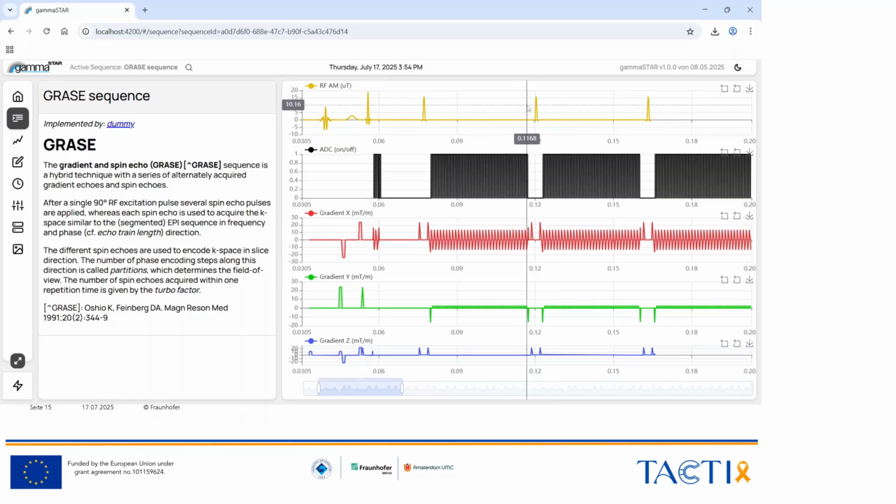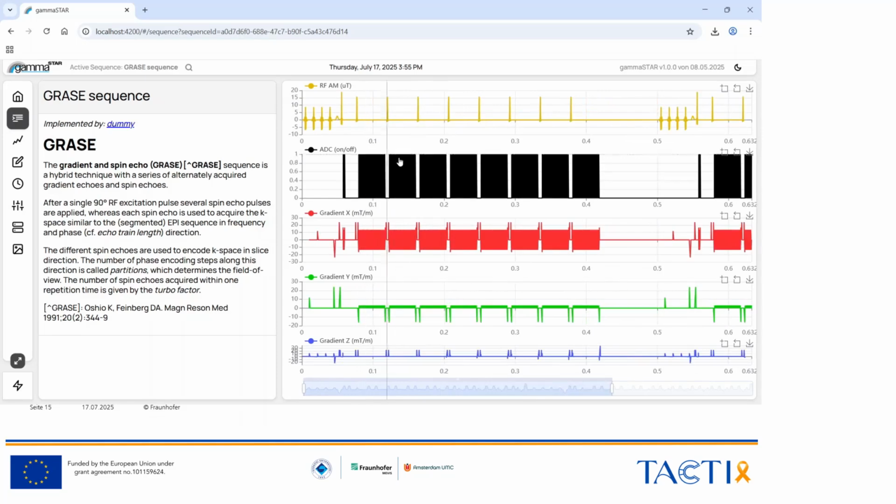We refocus the signal and acquire another slice, which means these pulses also need to be 3D pulses exciting a whole volume and not a single slice. So we excite a whole volume, we get the spin echo, read out a 2D slice, we get another spin echo, get another slice, and with that get our whole 3D volume. And in this case, 1, 2, 3, 4, 5, 6, 7, 8, a volume with 8 slices in, I don't know, 400 milliseconds.